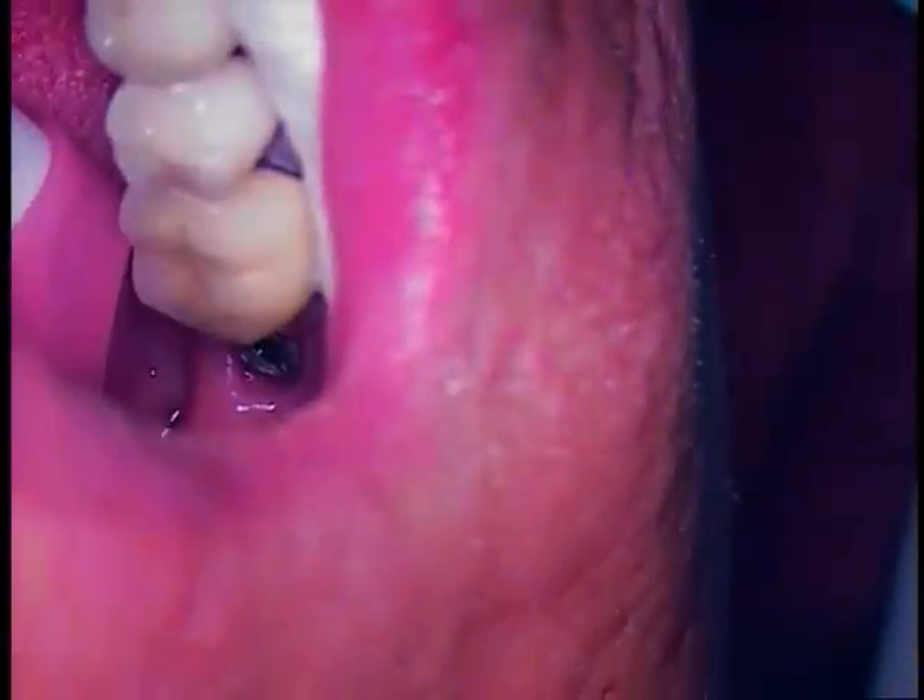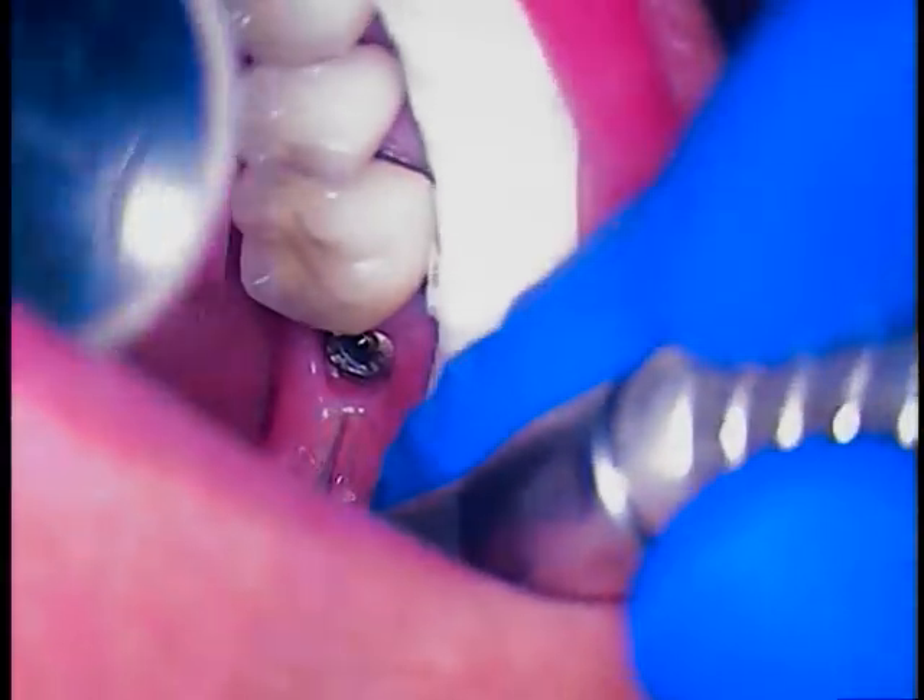My dental assistant is going to go ahead and dry that for me. Nice and wide. We're going to go right on up to about 12.5 power. Open wide again. All I have to do is sneak in and use the indirect vision as best we can.